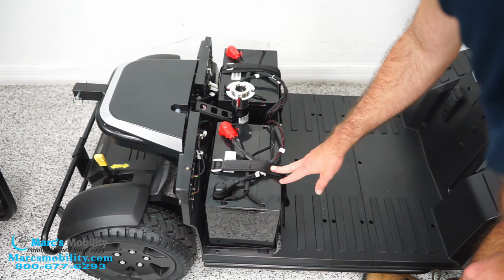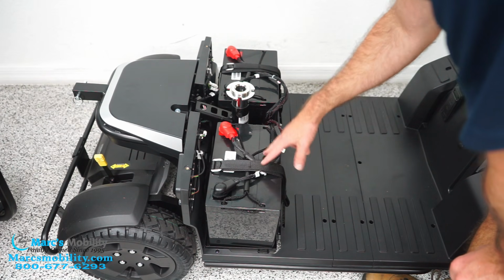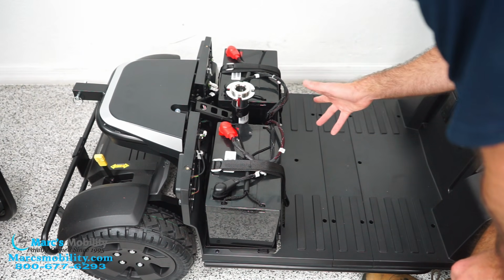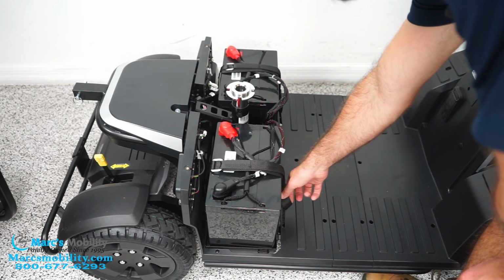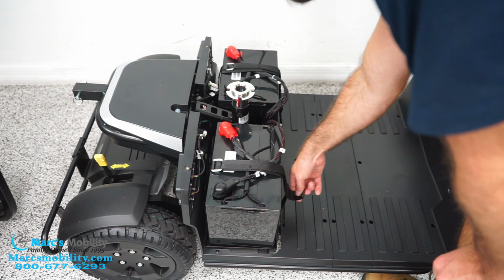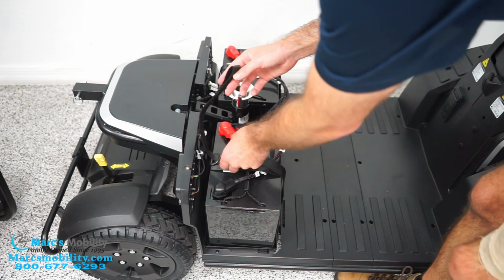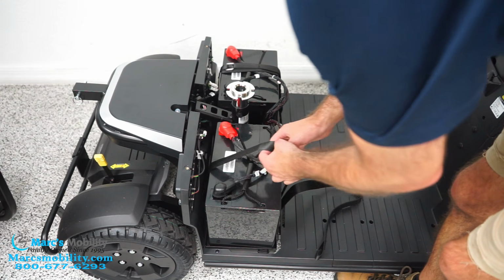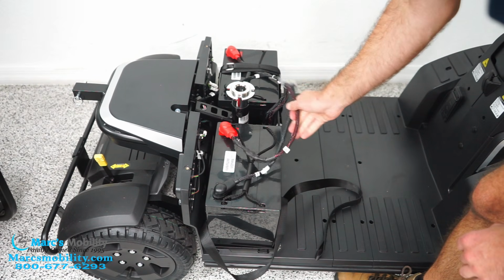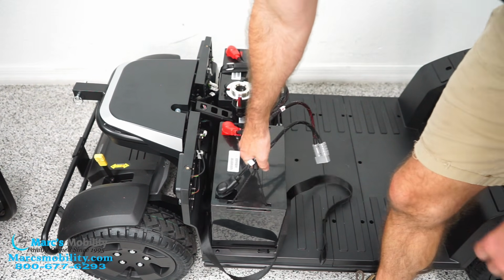When you are replacing batteries in this unit, it is recommended to replace both at the same time. They both will go bad at about the same rate. But I'm going to start by removing, I'm just going to do one battery for now, but like I said, you're going to do both. So I'm going to start by removing the straps that are holding it in. We're going to unplug the battery, and we're going to lift it out.